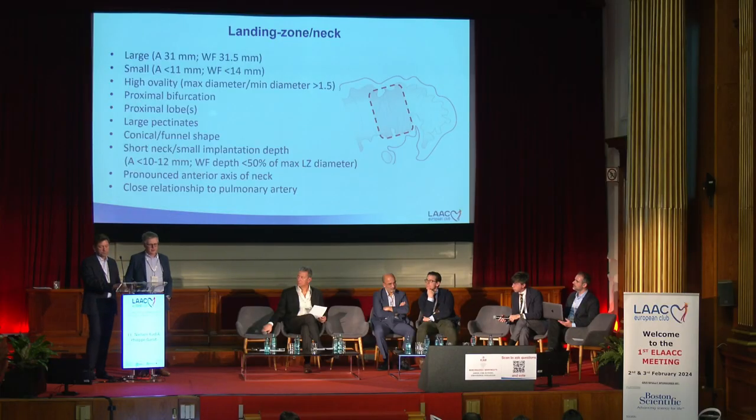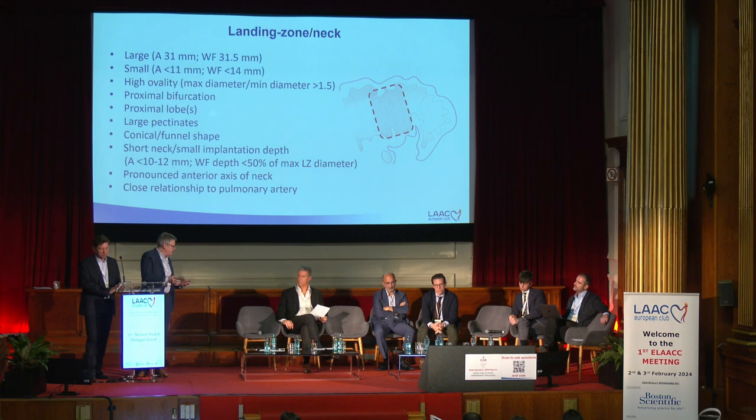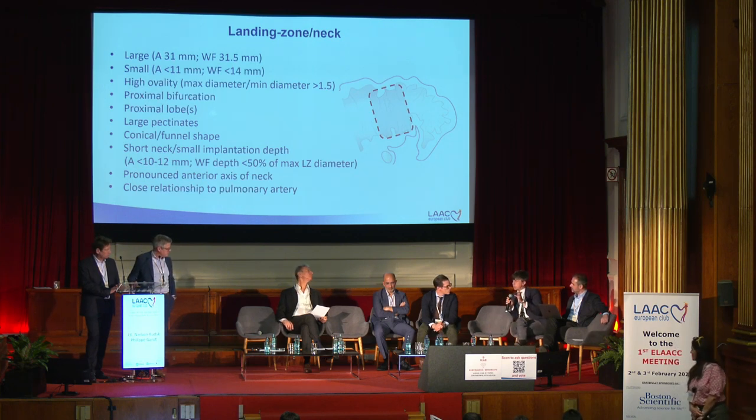Yeah, I get your point, but I also agree with Marek's comment that we have to be a little bit skeptical about mentioning specific devices, because it will change all the time and we'll get new devices. I'm also mostly in favor of just talking about a large landing zone or a small one, and then the implanter can think relative to the device I have in my hands or have planned to use. I don't think we need to be that specific. Then it will be very impractical. Maybe not just saying sandwich technique, we can say short neck that modifies your current strategy, or the regular strategy, something like that.